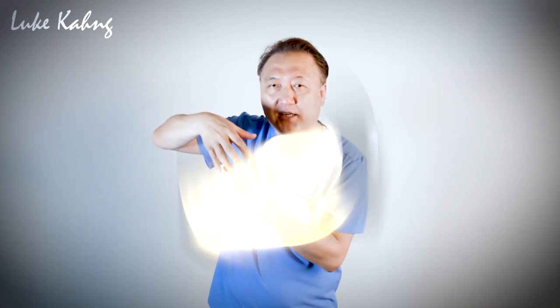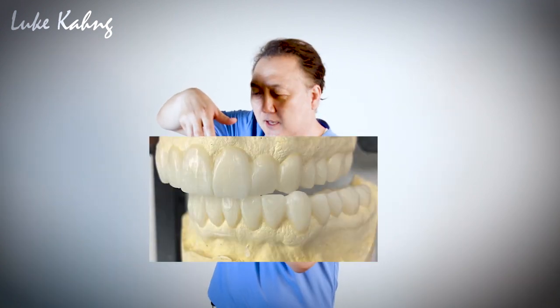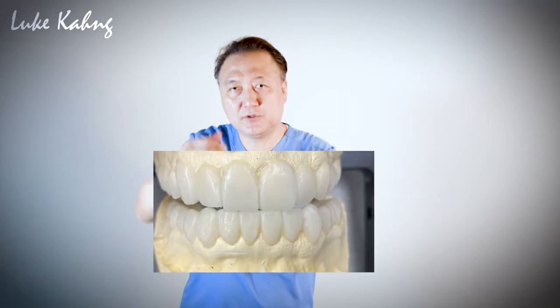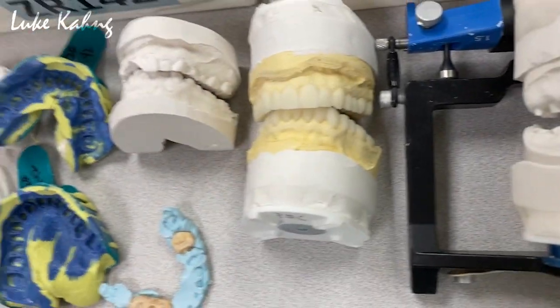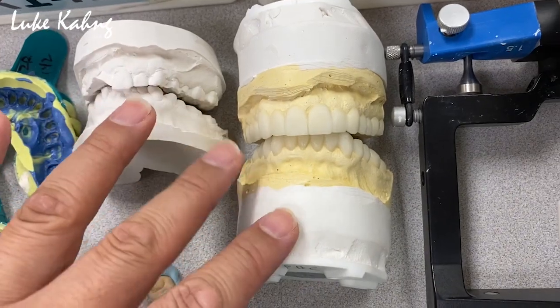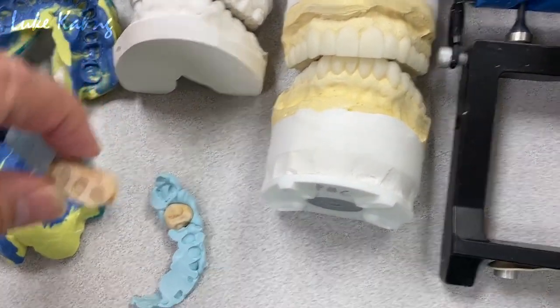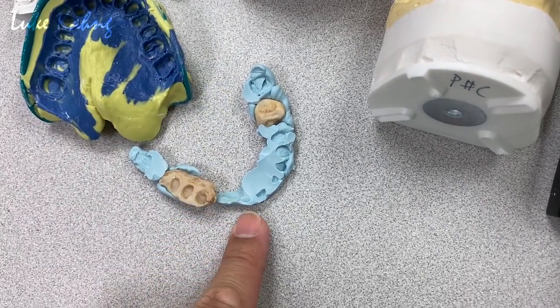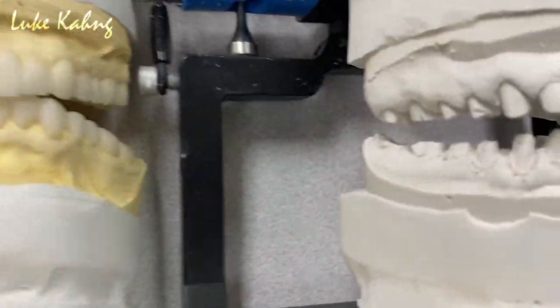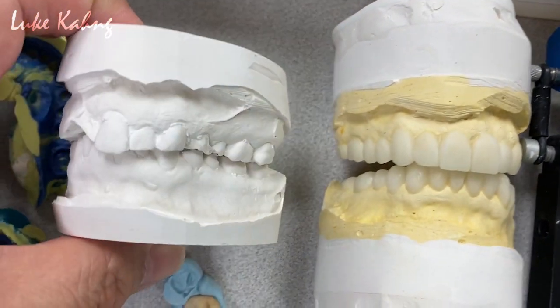Okay, so one dentition, whatever. So this case, I made a pretty decent wax up design with a class 1 bite, and then we give the dentist full guidance. Okay, so this is 28 teeth, and we trimmed up and waxed up previously. And the doctor did a great bite record, because we measure from the canine to canine from the old.